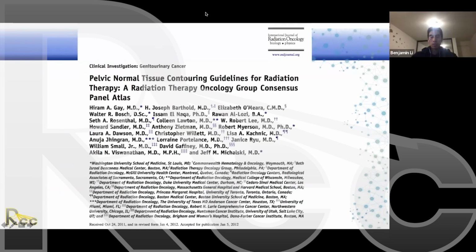Dr. Longo, we have one question about CT simulation. It's from WQ, who asks, what do you think about low residue diet on rectal volume? Oh, that's a really great question.